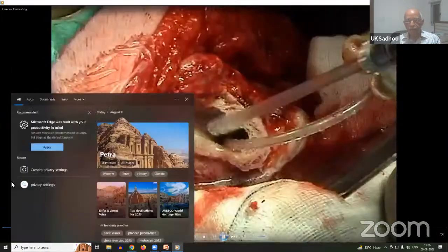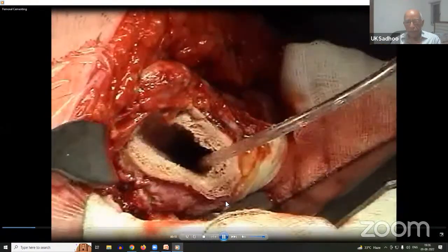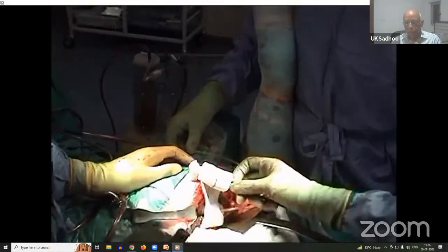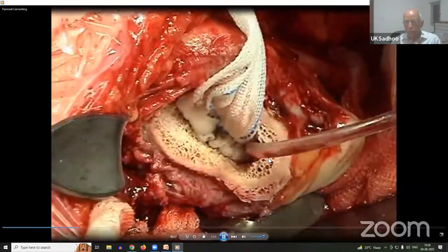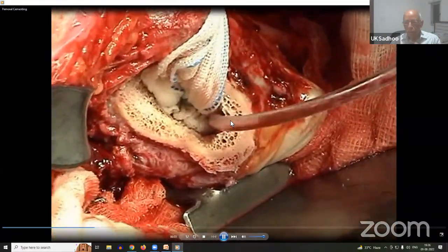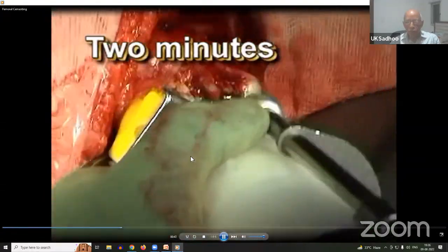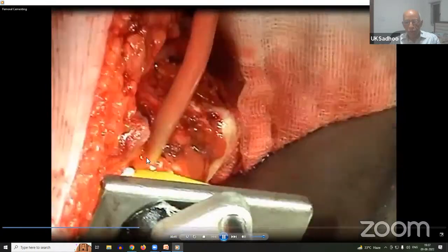So this is the femoral preparation, and you see thorough washing and almost a bone dry bone bed. The back end of the medullary canal, while the nurse is mixing the cement, this is the vent that has gone right up to the bone block, which has been put so that there is a vacuum created. That block doesn't allow the cement to escape down to the knee. Once you are prepared, so around 2 minutes, you pour that cement, and this is the proximal pressurizer.